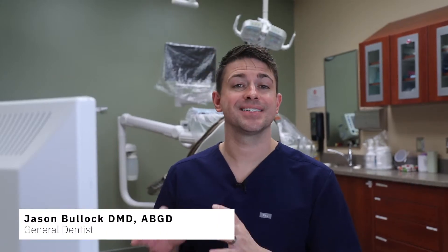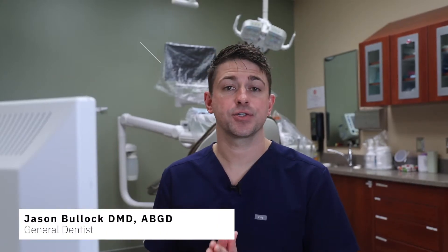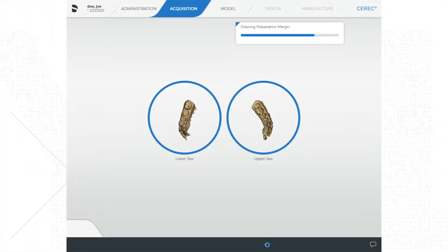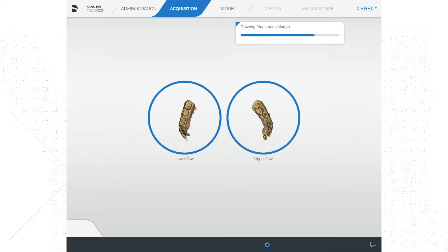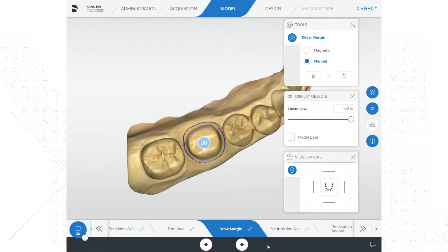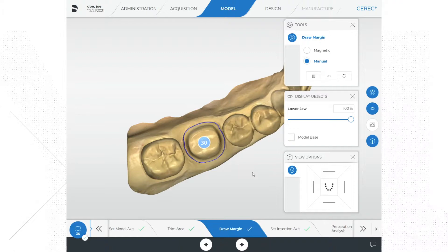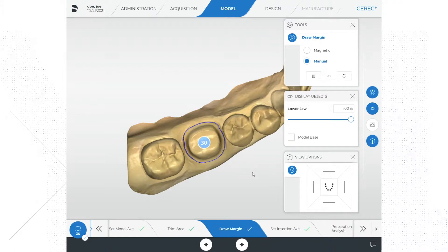The computer will analyze the scans and start to orient the models to each other. This is done automatically in this version of the software — actually a lot is completed automatically. The model axis is completed and the margin is traced automatically. In previous versions of the software all this had to be completed manually. Now it is all automatic.